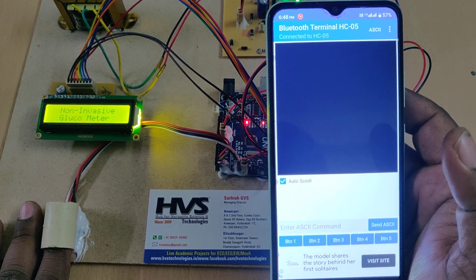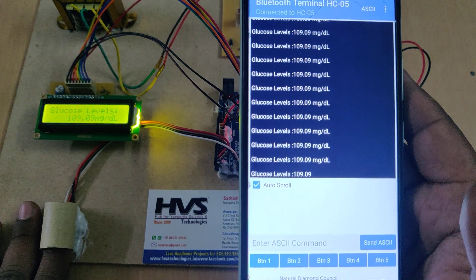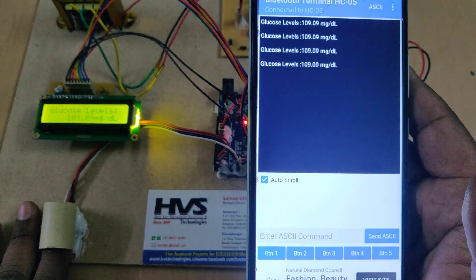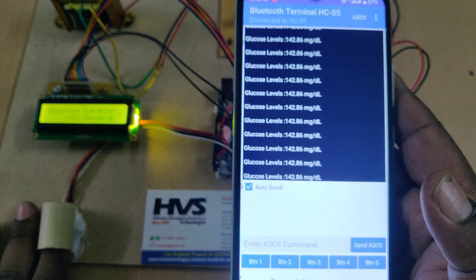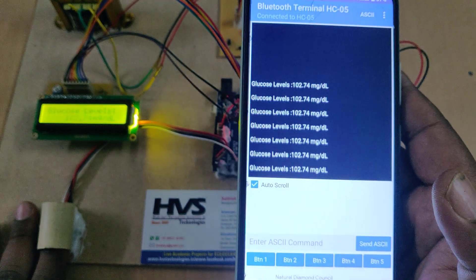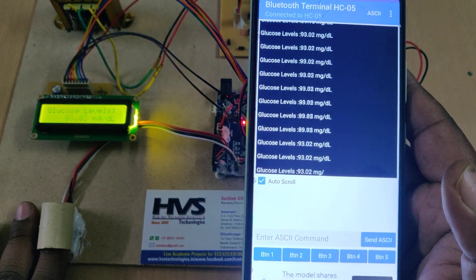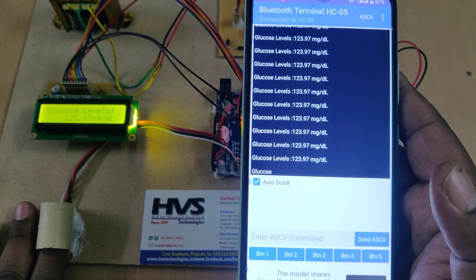It will take a maximum of 10 to 15 seconds to calculate the approximate glucose levels. The values will then be displayed both on the Bluetooth terminal on your phone and on the LCD screen. If you move your finger, you will get incorrect readings, so stay calm to get accurate approximate values.